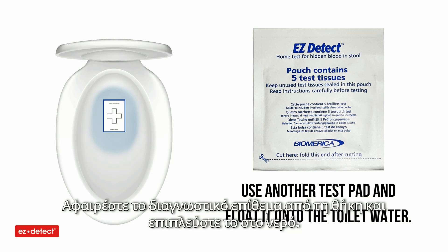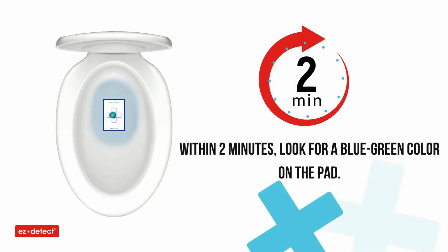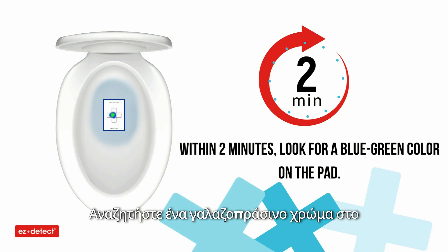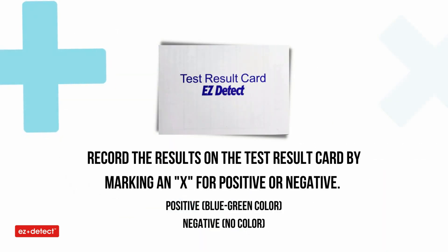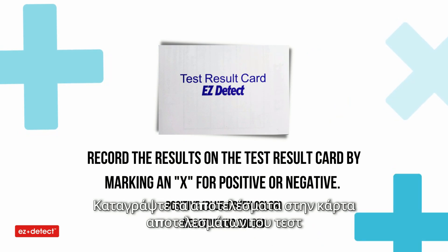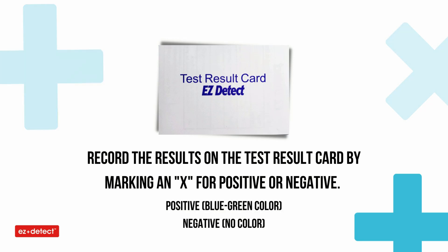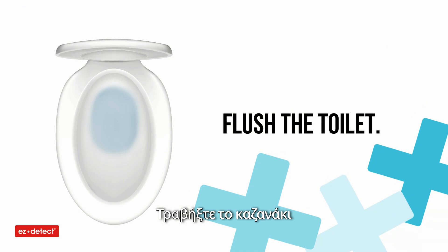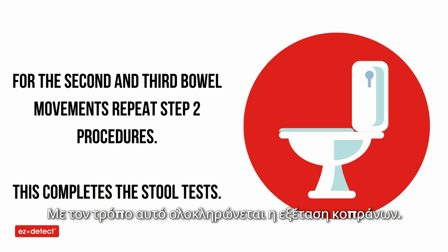Remove the pad from the pouch and float it onto the water. The pad does not need to touch the stool. Within two minutes, look for a blue-green color on the test area of the pad. Record the results on the test result card by marking an X for positive or negative. Flush the toilet. For the second and third bowel movements, repeat step two. This completes the stool test.